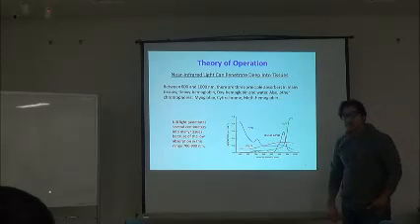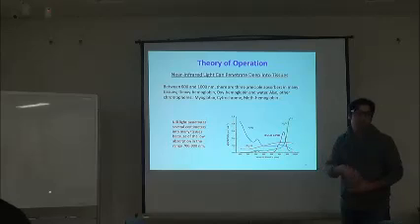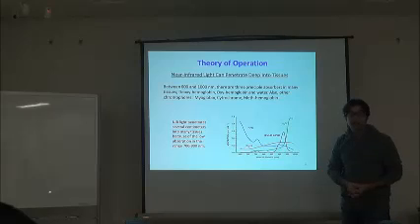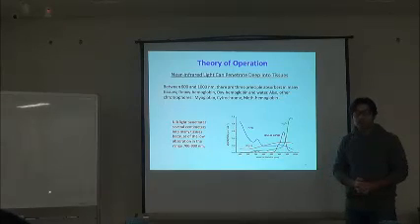Yes, there is a little absorption because of the small vessels, but that's also negligible. That's very small, because the near-infrared light can penetrate through the tissues and the vessels. But if there are large arteries, like if we are imaging our hand or legs, then that plays an important role. In case of the brain, we don't have major arteries in the cortical areas. We just have small vessels, so they don't contribute much to the absorption.